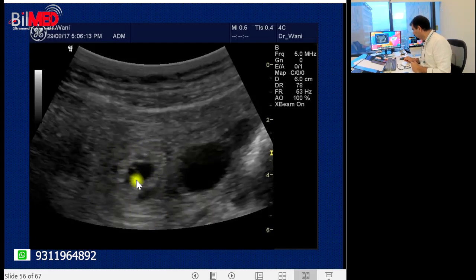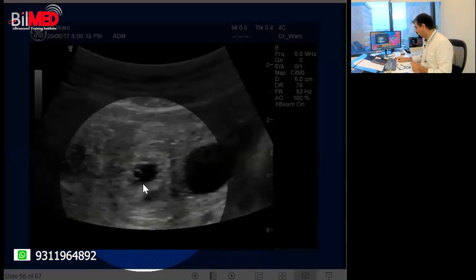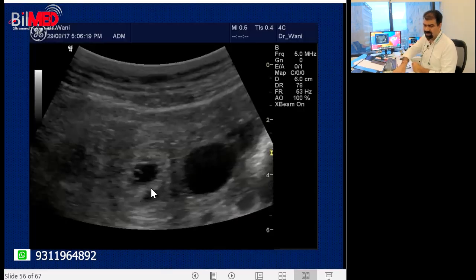Do I see some cystic structure in this cyst? Yes. What is that? What is this over here? Yolk sac. Very good. So it is about 101% diagnosis, not 99.99. This is 101% diagnosis of ectopic pregnancy.